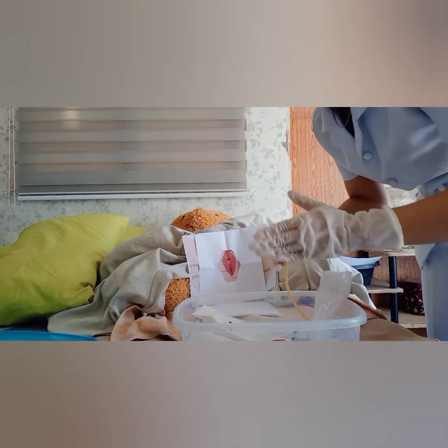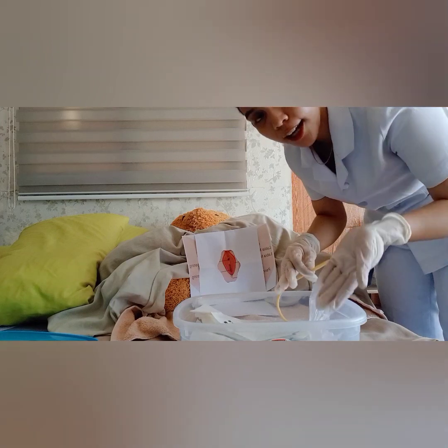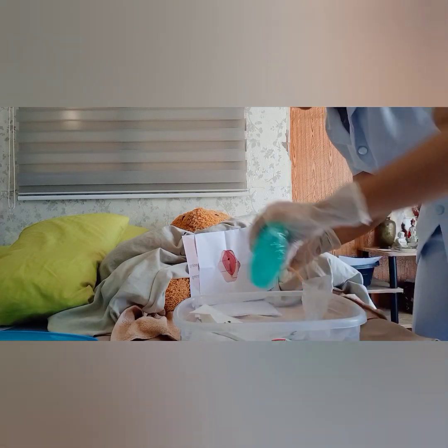Okay, so the next thing, once the eye sheet is put onto our client, we are now going to lubricate the catheter for about 1.5 inches, being careful not to plug the eye of the catheter. So the rationale for this is to reduce friction and irritation when the catheter is being inserted to our client.